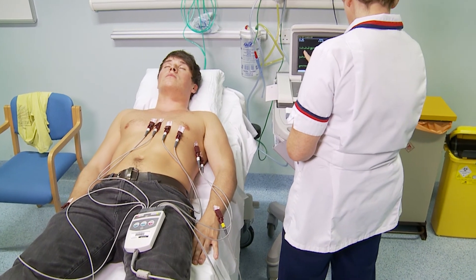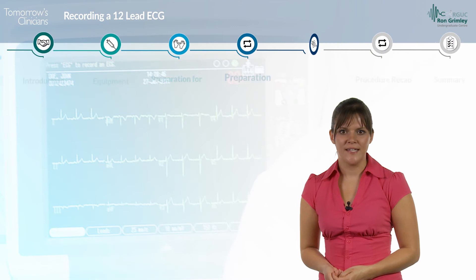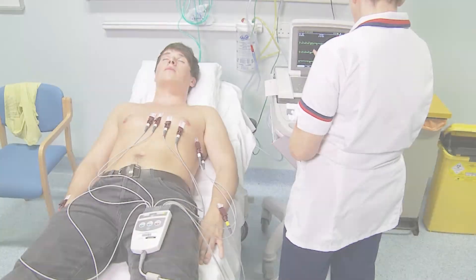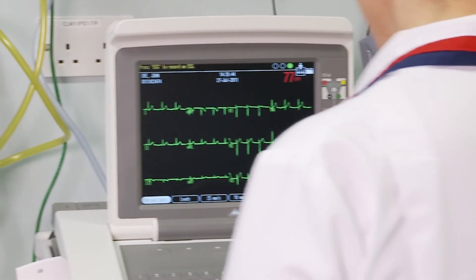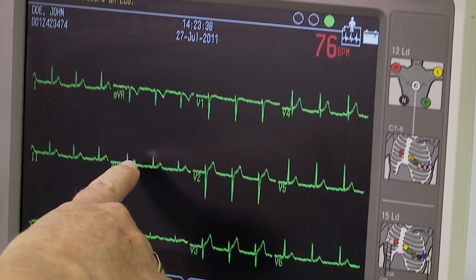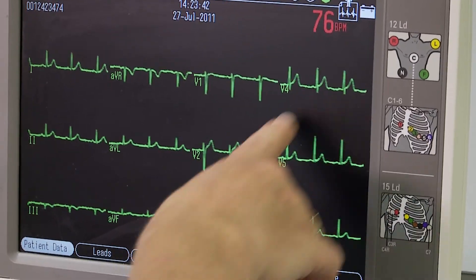At this point, if you have a female patient, you may wish to cover the chest to help maintain the patient's dignity while you proceed with the recording, ensuring not to disturb the lead attachments. Ask your patient to be completely relaxed and breathe normally. When you are ready to record, double check your settings and check the screen to make sure that all of the leads are connected and producing a satisfactory tracing.